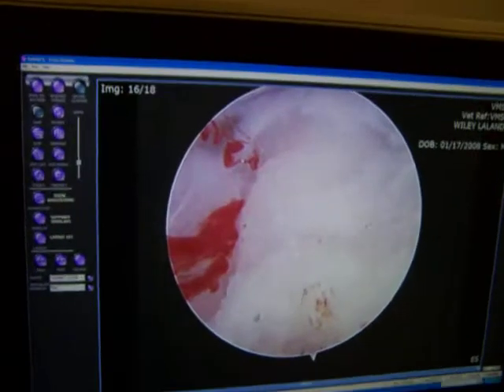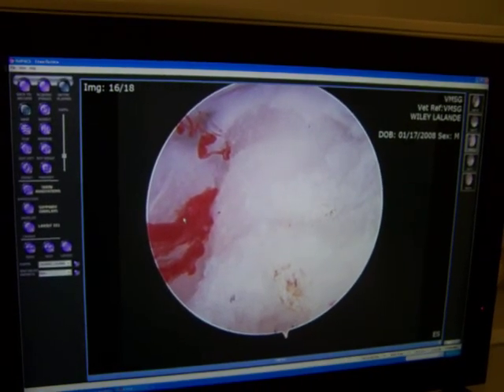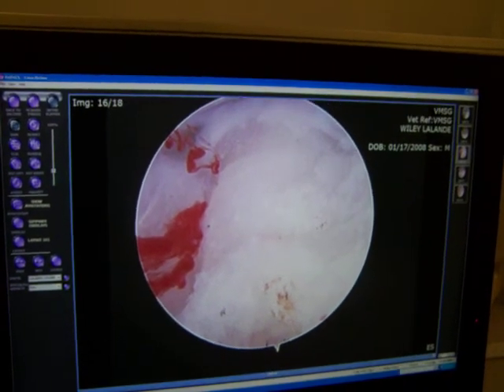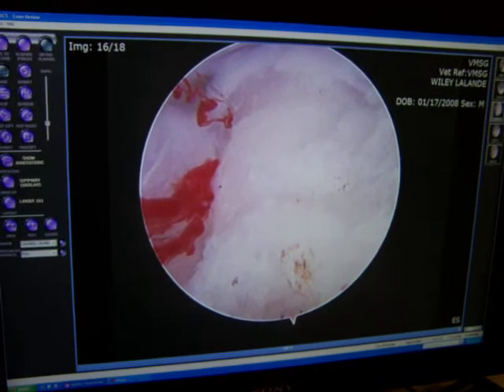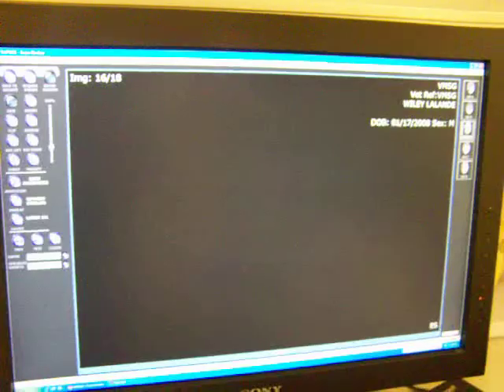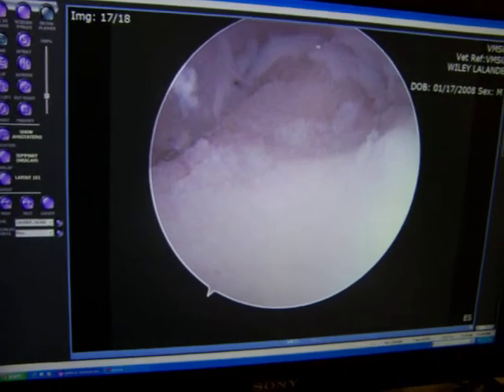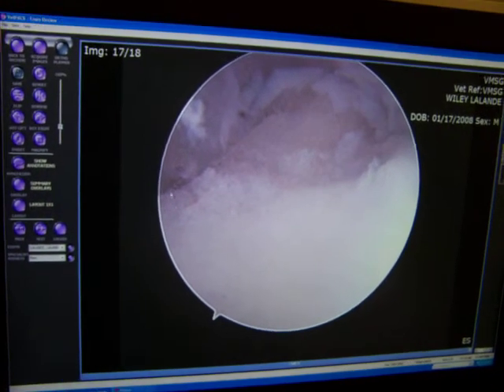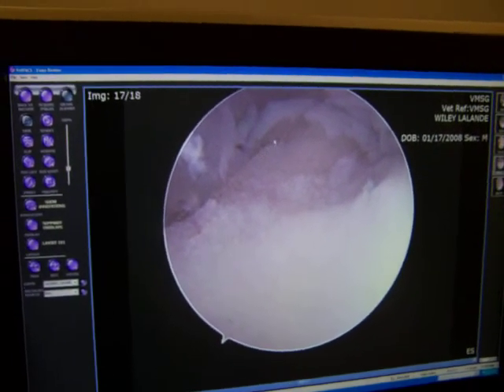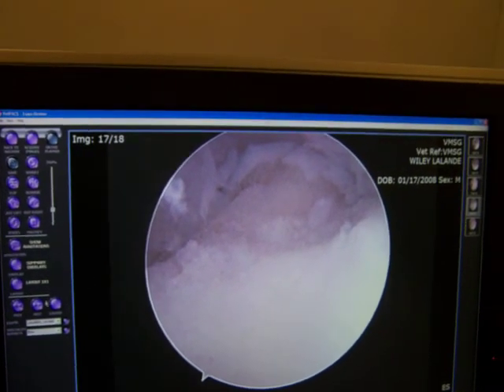You can see blood coming up out now — that means we're effective in restoring blood supply out of the bone. The vessels will follow, and then the stem cells will follow the vessels. We put three holes — that's a great sign. This is the top of the crater here coming down, nearly the whole lesion right there. Looking at the depth, it's about a millimeter and a half here and another millimeter — so probably a millimeter and a half to three millimeters total depth.